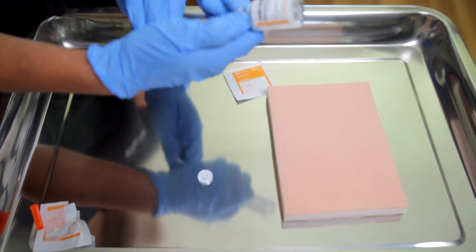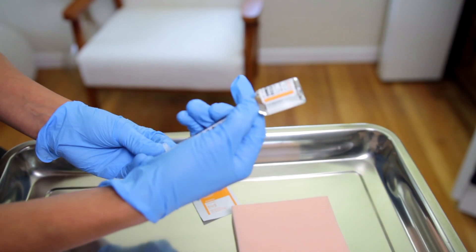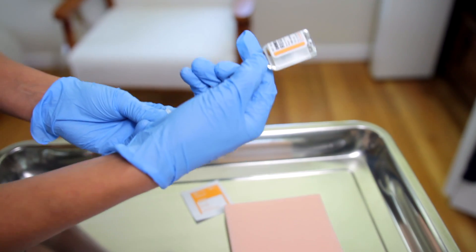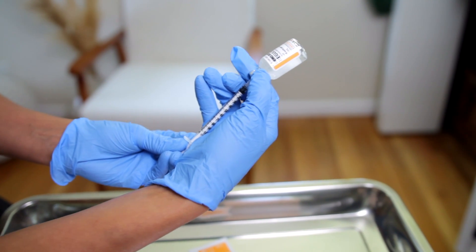I am then going to invert the vial upside down, and this is where I'm going to withdraw the three units. So this is one, two, three. So that is three units.